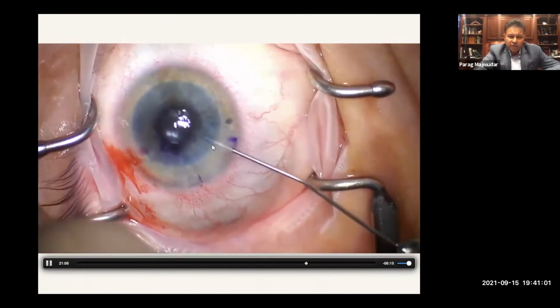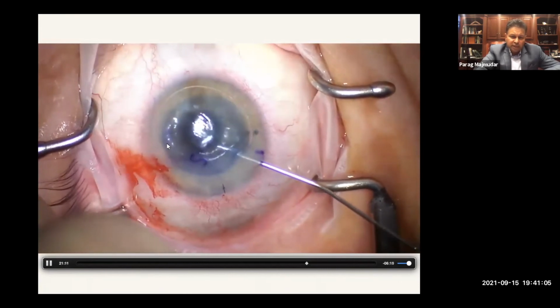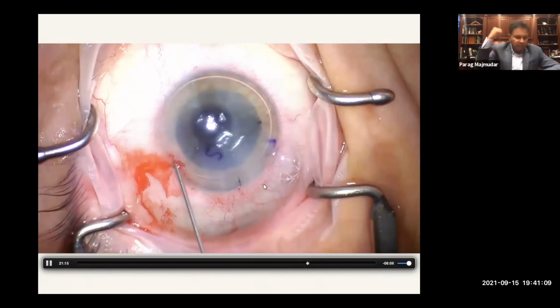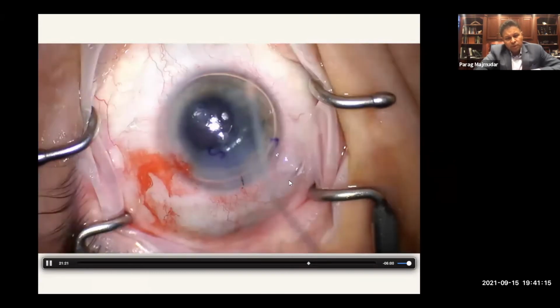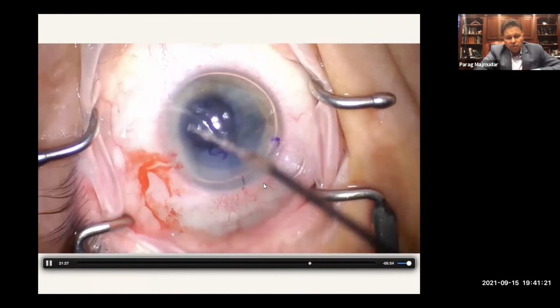And you can see the cannula is turning blue, so I know I'm under the graft. Careful not to go onto the endothelium, but you don't want to inject on top. Otherwise, you'll have to remove all the air and go back to square one again. So here it's underneath, and I'm getting a nice, firm fill, and I am pretty much done with this procedure.